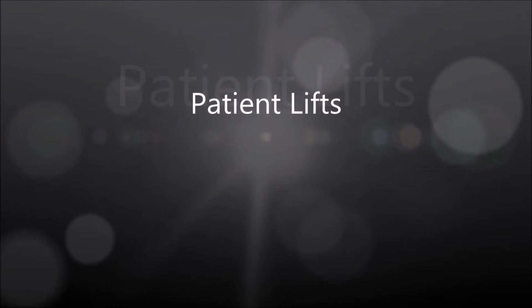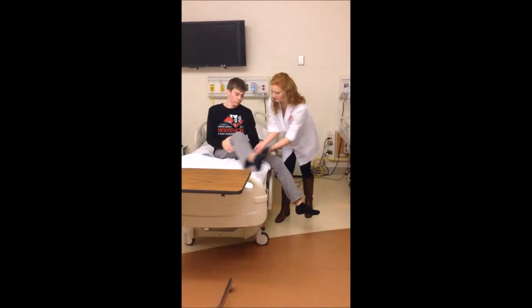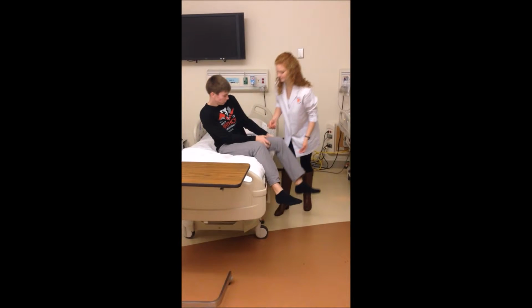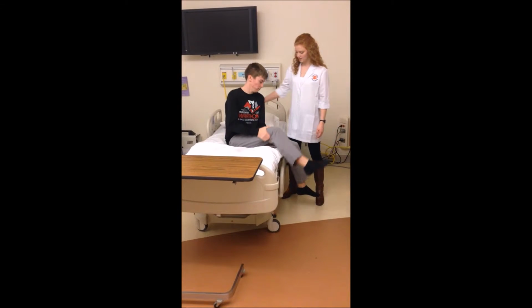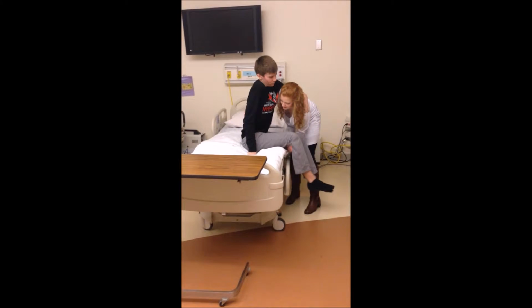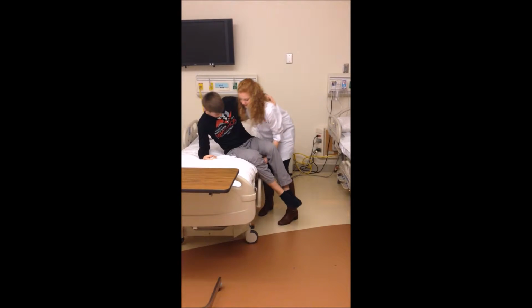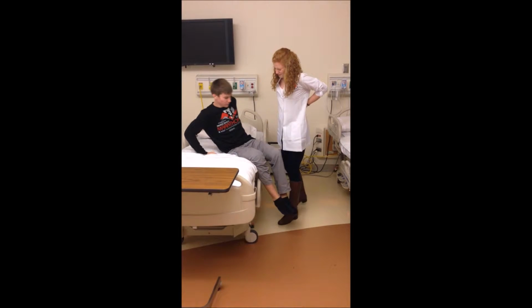The purpose of this video is to explain the need for patient lifts, what patient lifts are, and the advantages and disadvantages they pose for nurses and patients. Nurses injure their backs frequently due to manually lifting patients. It is reported that 52% of nurses complain of chronic back pain and injuries. These injuries can debilitate nurses and cause them to be unable to perform their jobs adequately. This problem can be solved with the use of patient lifts.